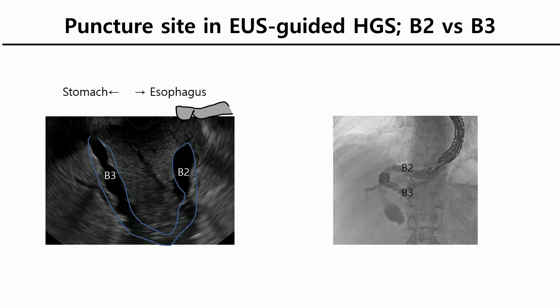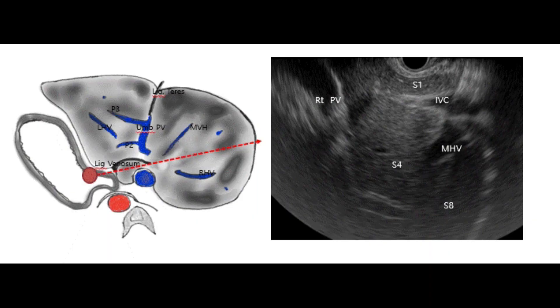This slide shows a dilated bile duct of the left liver, B3 and B2. On the fluoroscopy imaging, I punctured the B2 area with contrast injection, and the bile ducts B2 and B3 were visualized. This demonstrates how to examine the left liver by EUS.